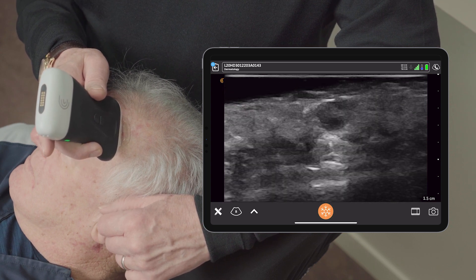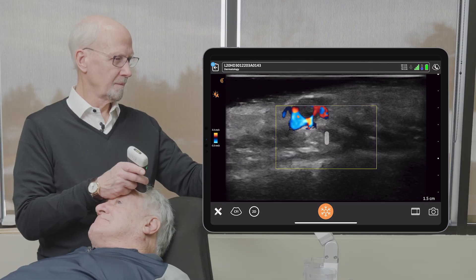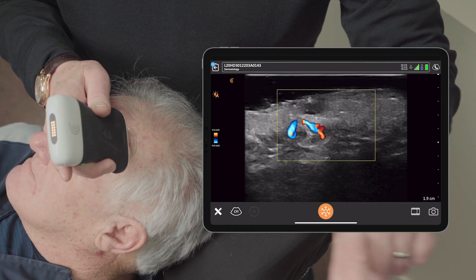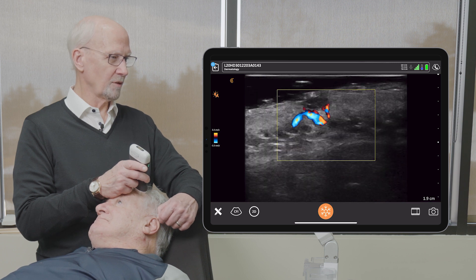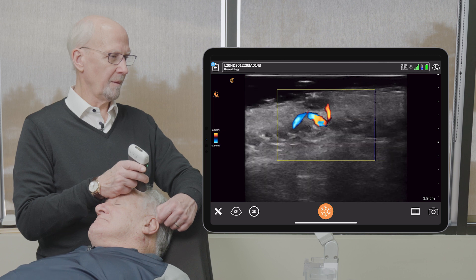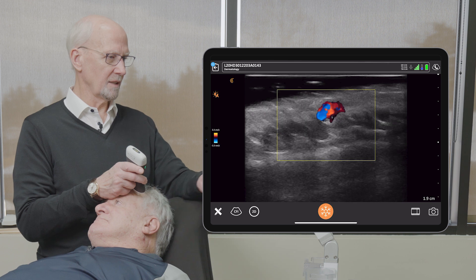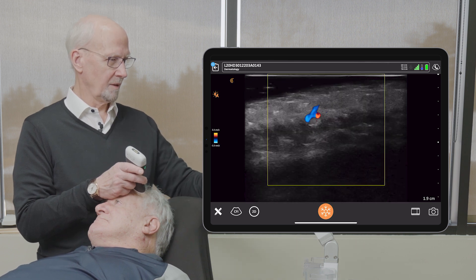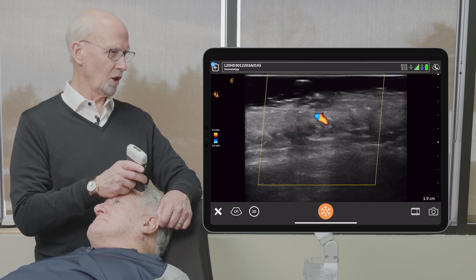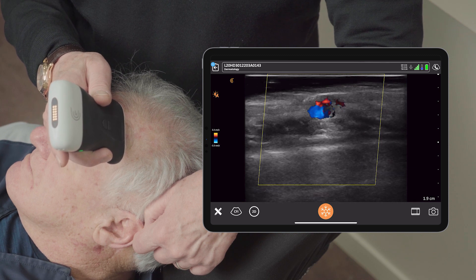Let's look at vascularity. We can see that the vascularity is really limited to this lesion. This is a real advantage of using ultrasound because we can see where the vascularity is. So we see the vascularity is limited to the lesion that we're examining.